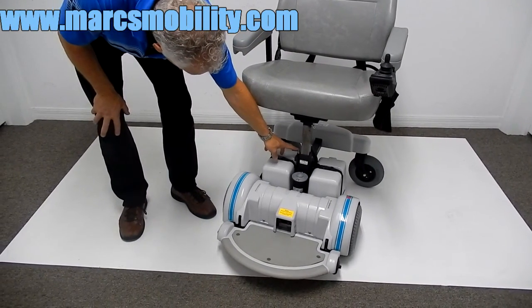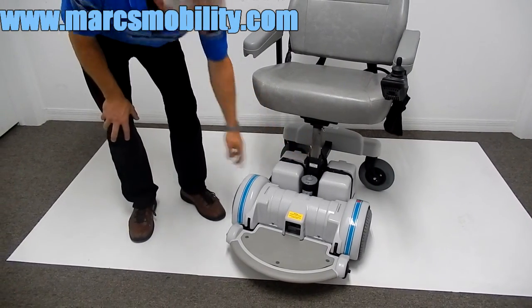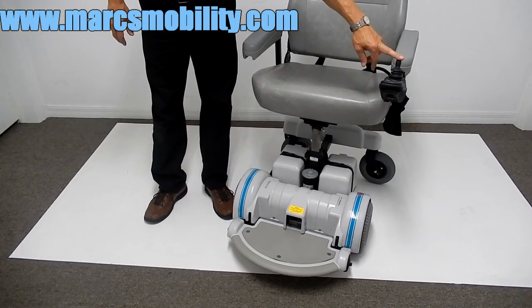There's a sensor right here that stops the chair from going forward until the seat is pushed back down. So if you want the chair to move, you need to bring your seat back down, then your chair will drive.